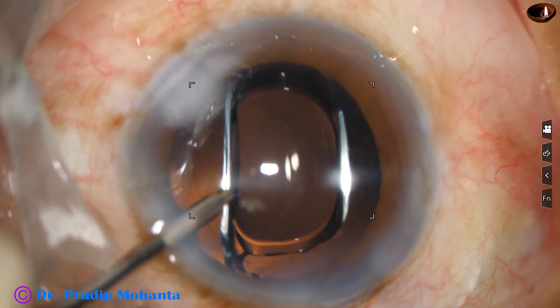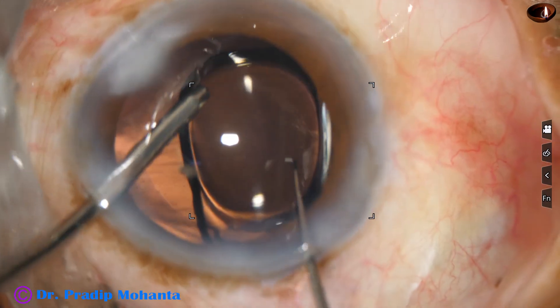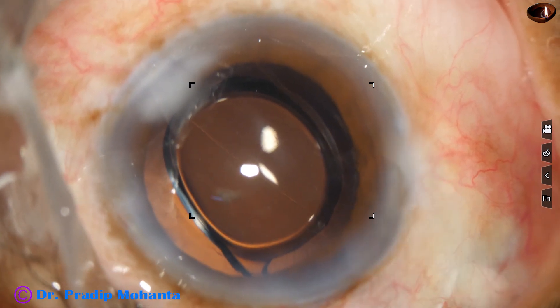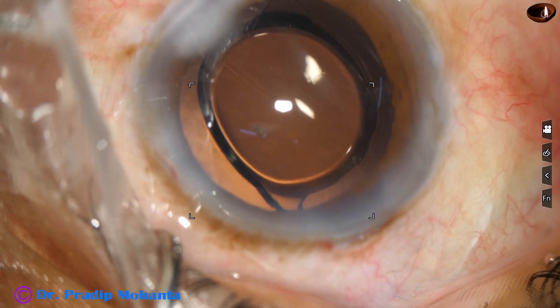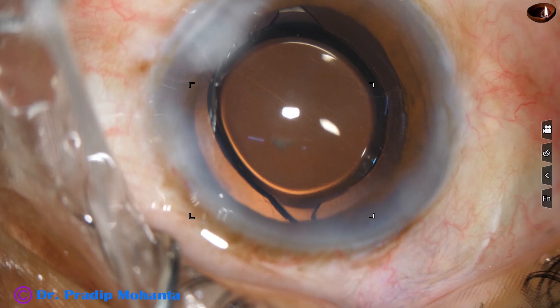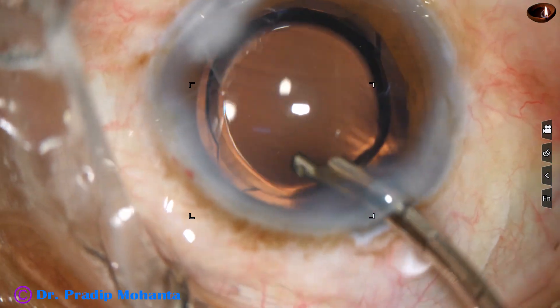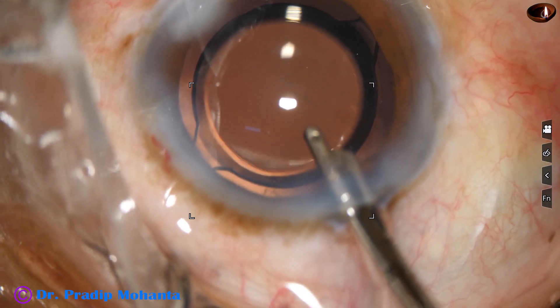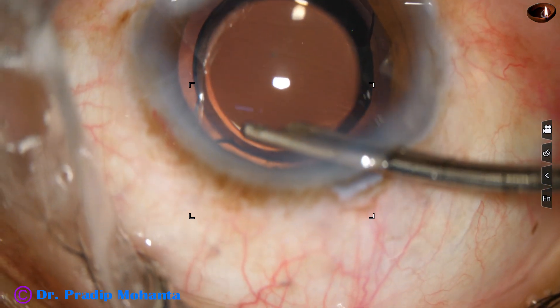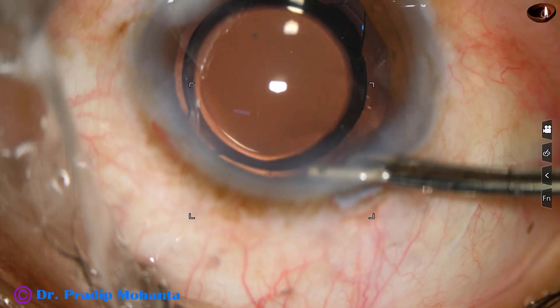To check whether the haptics are in the bag or not, I use a Sinski hook, and I find that both the haptics are in the capsular bag. This is a bit of Moxifloxacin. The side port is closed by hydrating the corneal stroma. Final lavage of the anterior chamber is performed. The anterior chamber is nicely lavaged and nicely formed.